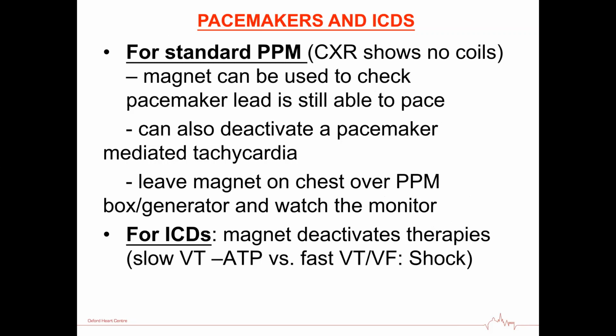But essentially, on almost all resus trolleys in ED, there'll be a little blue magnet. You put that over a pacemaker box. It switches a little reed switch within the pacemaker to the pre-programmed manufacturer settings. And those vary depending on who the manufacturer of that pacemaker is, but it'll always be a rate around 90.